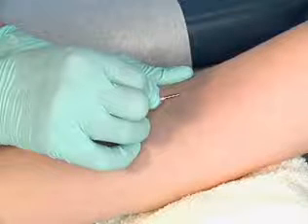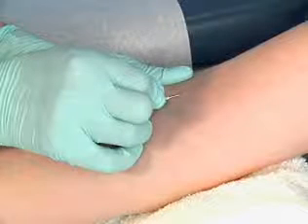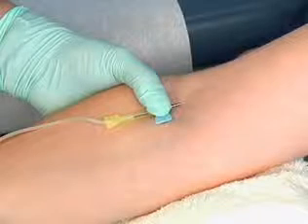If the needle is in the vein, a flash of blood will appear at the top of the tubing. Thread the needle forward an additional 1/4 of an inch inside the center of the vein. This prevents the needle from coming out of the vein. This is known as seating the needle. Seating the needle lets you use both hands for changing tubes. Spread open the butterfly wings and securely rest them flat against the skin.